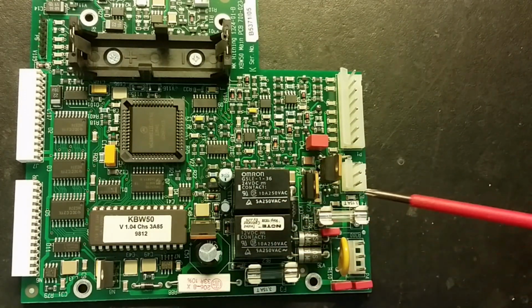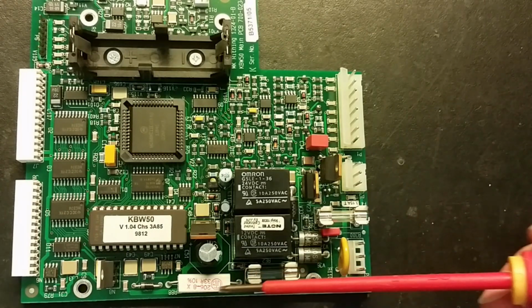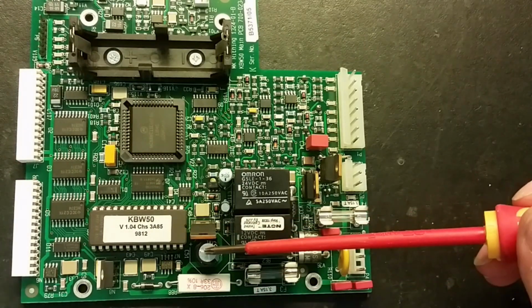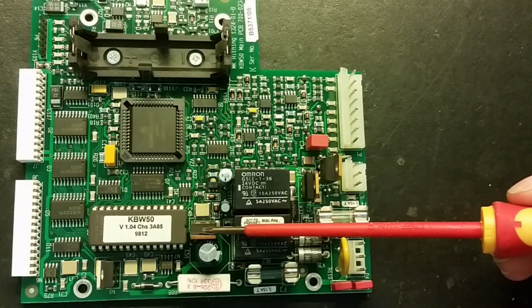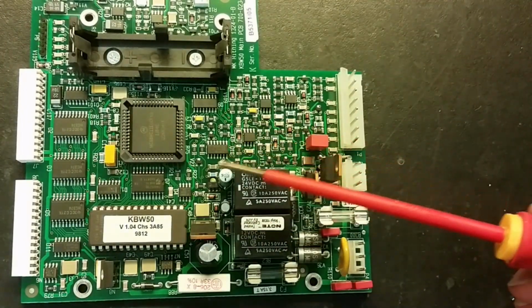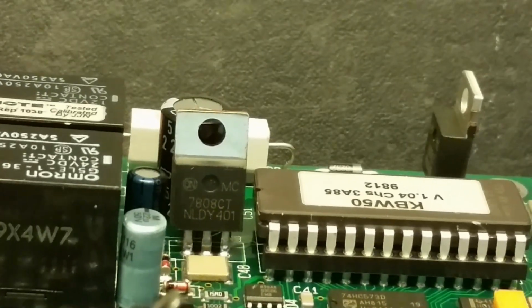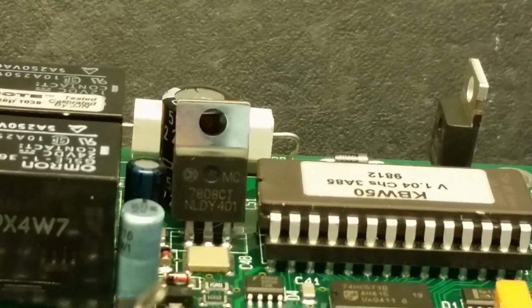We've got some fuses, one for the battery here and one for the mains from the transformer. Got a 0.33 ohm shunt. Got a smoothing capacitor. This one is a 5 volt regulator and this is an 8 volt regulator. I've never heard of an 8 volt regulator before. What do you use that voltage for? I have no clue. Yeah, 7808 CT, 8 volt regulator.